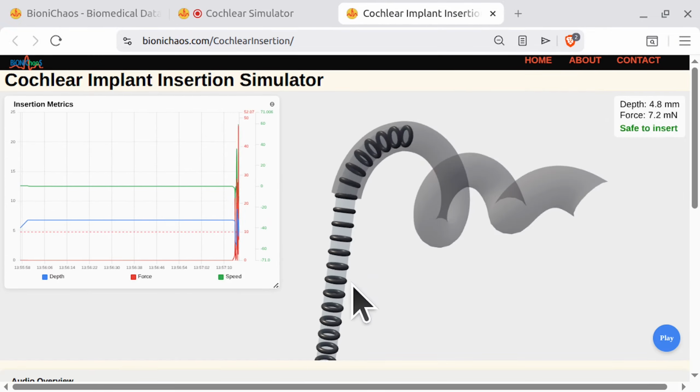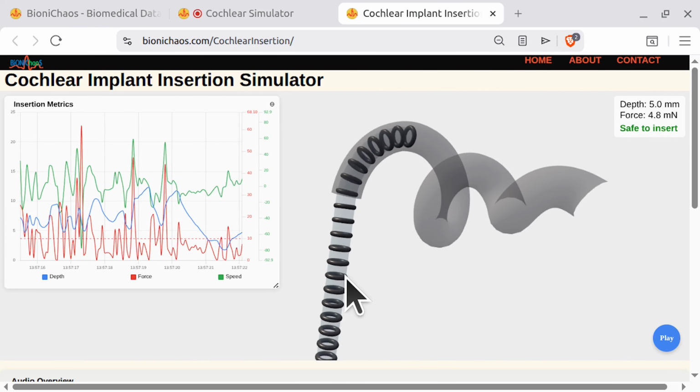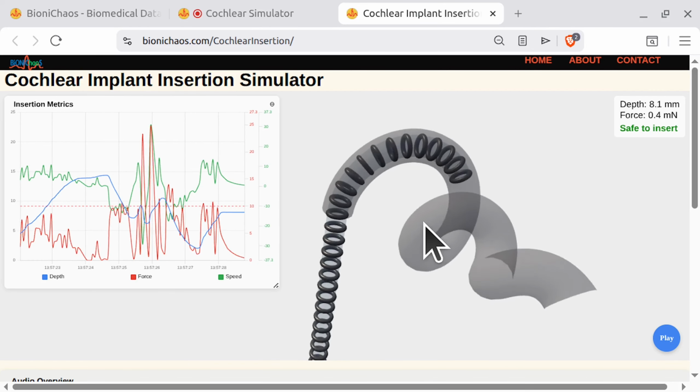Okay, but as for the facial twitching, we use continuous intraoperative monitoring now. Always? Standard practice. The entire time the patient is asleep, we are watching the facial nerve's electrical activity on a monitor in real time. If we get even slightly too close, the monitor alerts us.